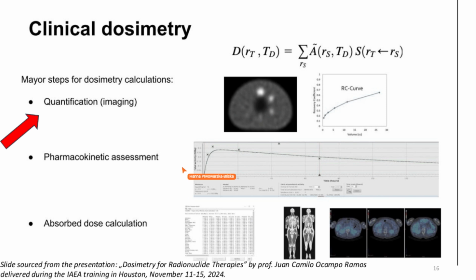Next slide, please. Let's assume that the specific nuclear medicine center has managed to influence the decision makers to implement internal dosimetry for clinical practice. So what will be the first steps of the physicists? What should they start with? First of all, they need to select the dosimetry programs. There are lots of such programs. Sometimes people ask me which program should be purchased. Then I answer that you should use programs that you understand very well; you shouldn't use black boxes.